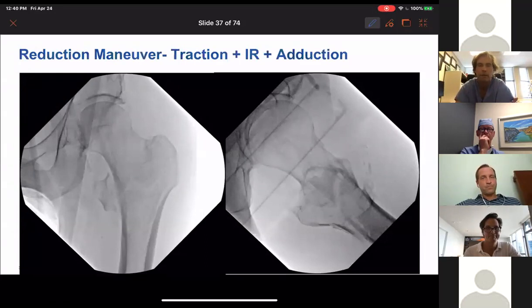Yeah, we're going to talk about that in the next case because I think that's really, yeah. Tom, what do you think? I don't want to throw the discussion into chaos, but you said we're going to standardize the beam. Would you operate on that image on the right? Yeah, I did. So that's one of the things. I mean the reduction, I mean the image. Would you use that image to operate? No, I would use that to judge the reduction. That's the over-rotated lateral that I was talking about before in order to assess the reduction.